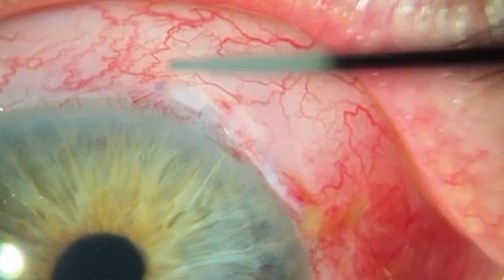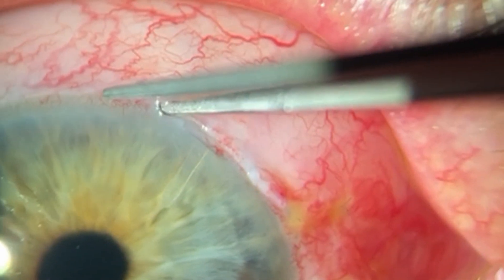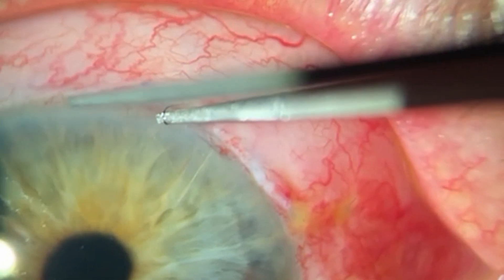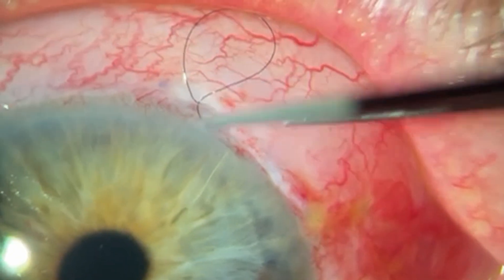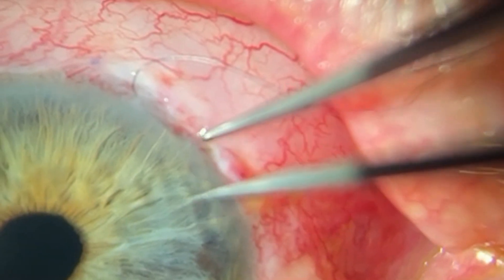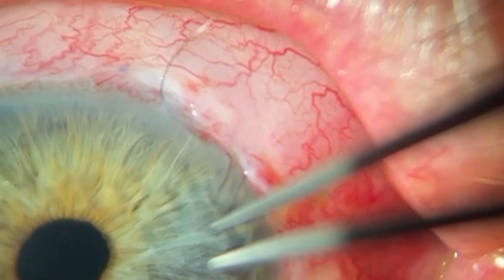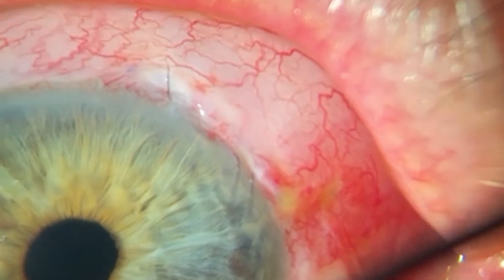So let's get to it. At the slit lamp make sure you gave the patient some numbing drops, take a small tying forceps and push the conjunctiva back until you see the suture, and then take one end of the suture out from under the conjunctiva, go find the other end and pull that out from under the conjunctiva, and only then pull the suture through the cornea.